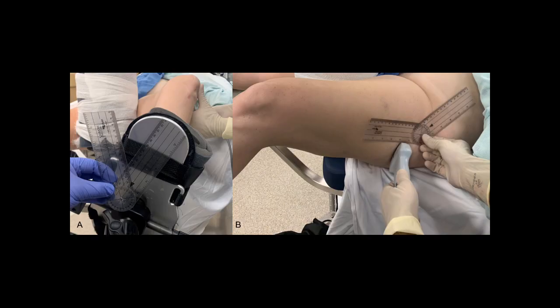Here the limb is flexed, and again ultrasound assessment is made in multiple rotational positions. One advantage of using ultrasound to measure the alpha angle is several different limb positions can be obtained expeditiously without any increased radiation to the patient. Next, the ultrasound alpha angle measurement technique will be demonstrated in a right hip in a flexed and externally rotated position.